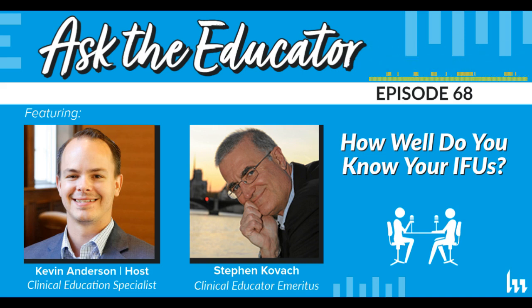So now if we start following the IFU, people say, now I need 50 more people or 10 more people. I can't do sonics for 10 minutes. I can only have 5. You recently were a manager, Kevin. What do you think of people like us coming in and saying, well, you should be doing this? How do we help them think this through?